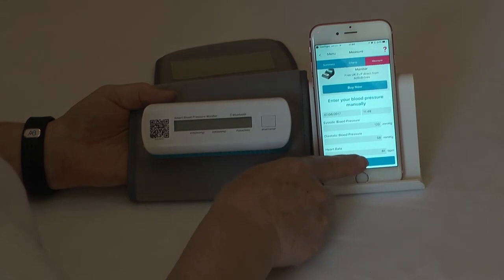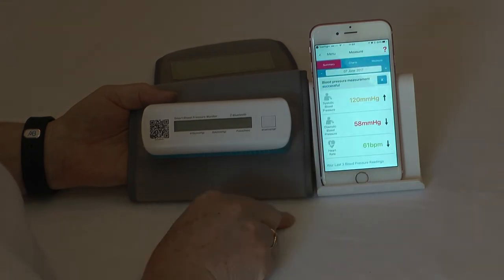Here you can see the readings that you have just manually entered. The systolic is 120 and has increased — the arrow at the side indicates that. The diastolic is 58 and it is lower than the previous reading. The heart rate is 61 beats per minute, and that is also lower than the previous reading.